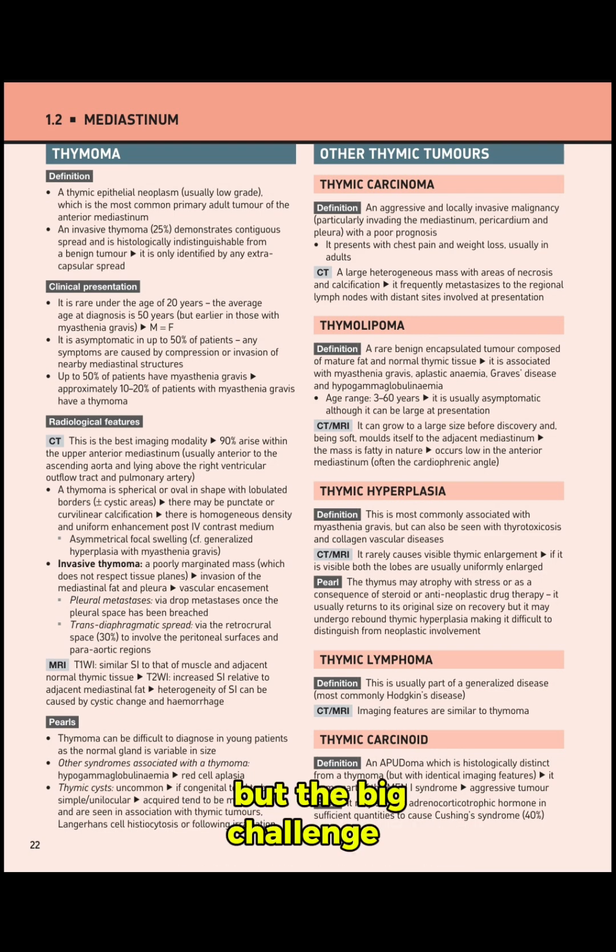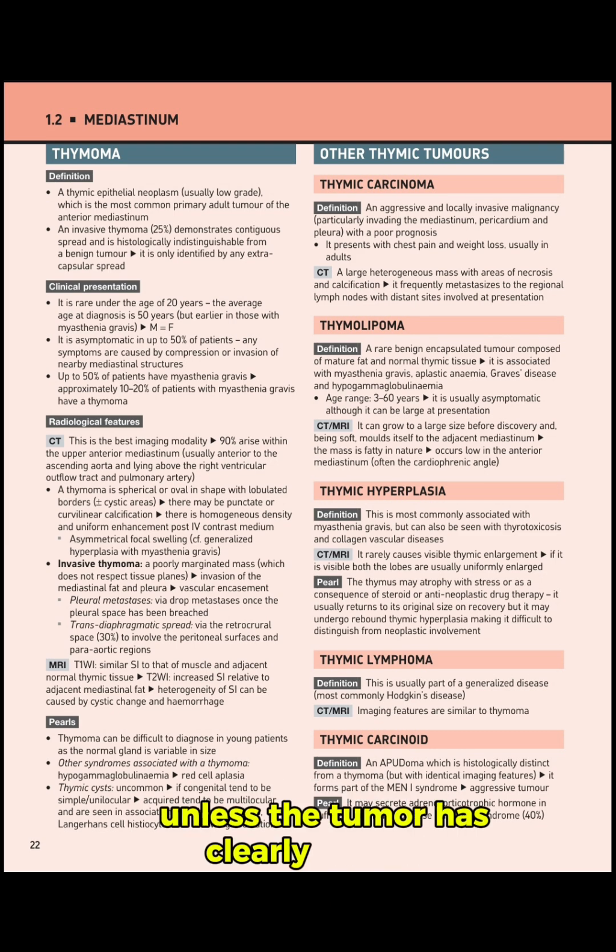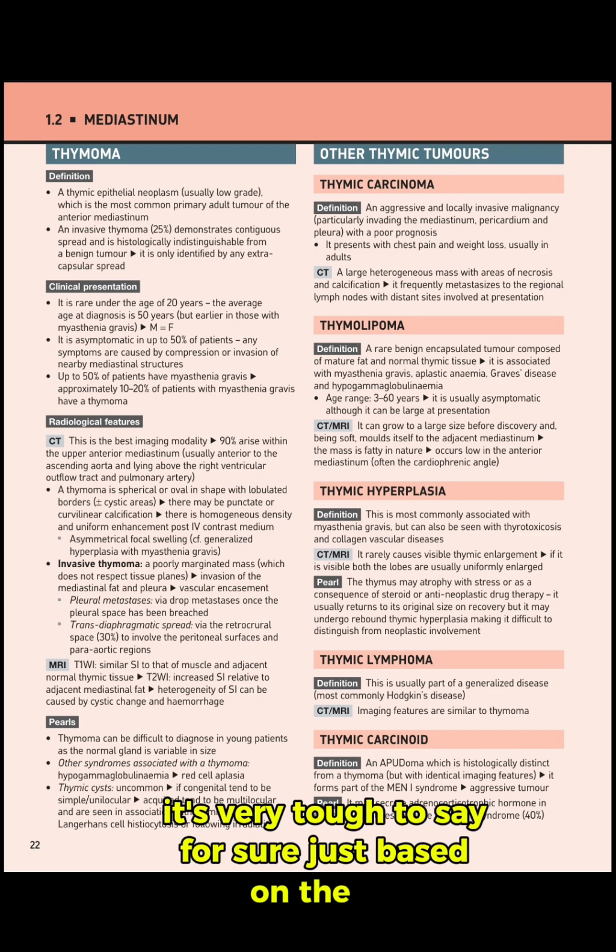But the big challenge is determining malignancy purely on CT. Unless the tumor has clearly invaded nearby structures, it's very tough to say for sure just based on the CT appearance.